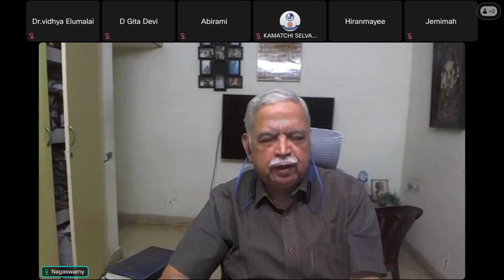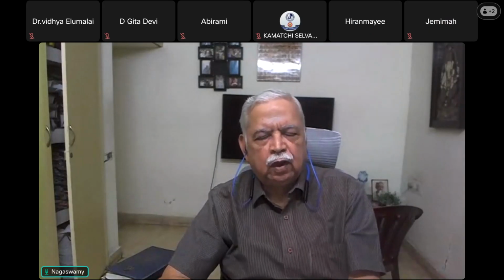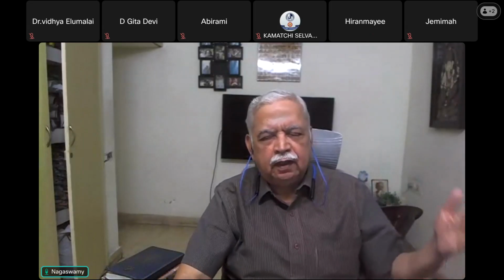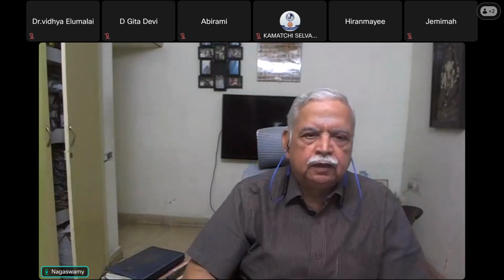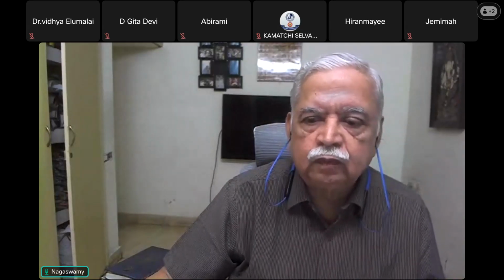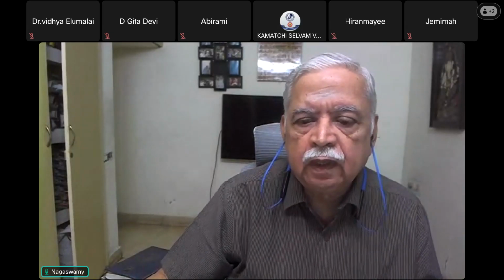Restrictive: FVC may be reduced, FEV1 may be reduced, but the FEV1 to FVC ratio is normal, TLC is low or reduced. That is restrictive. If there is a reduction in FEV1, FVC, FEV1 to FVC ratio with a reduction in TLC, it is a mixed pattern. So it is as simple as that. Nothing to get confused about. So I hope you will be able to use that knowledge in the exam.